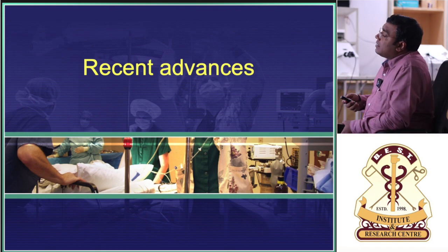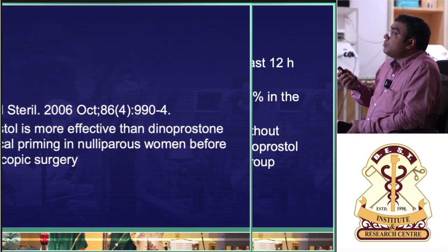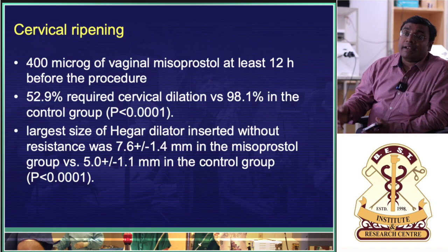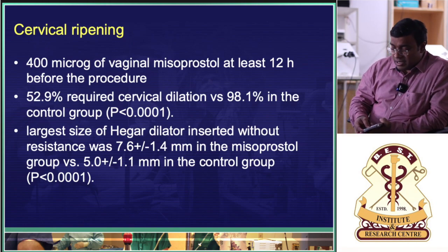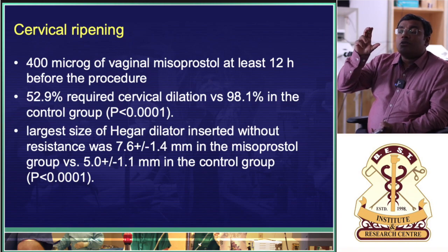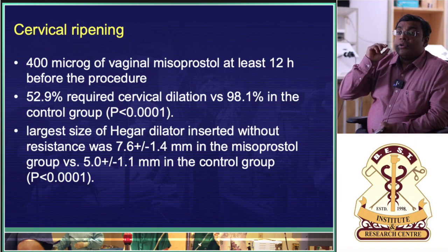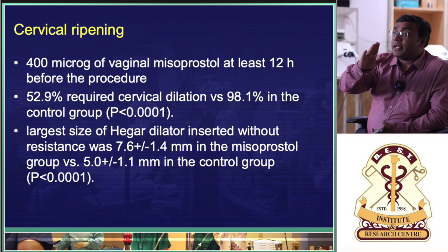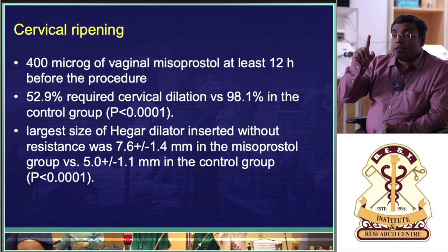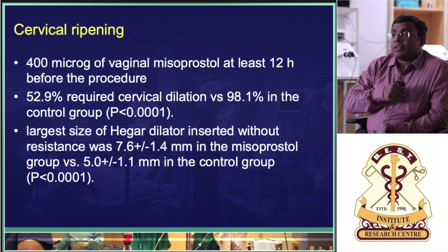What you should understand is that when it comes to hysteroscopy, a lot of us take it very lightly. Oh, it's just a hysteroscopic procedure. But the problem with hysteroscopy is that the threshold between morbidity and mortality is very narrow. So patients who develop a morbidity have a very high chance of mortality in hysteroscopic procedures as compared to laparoscopic procedures.